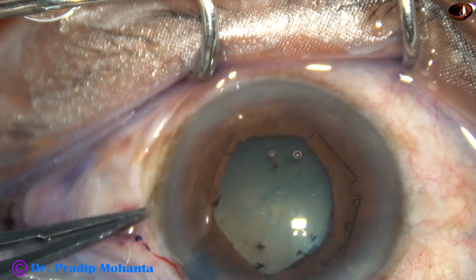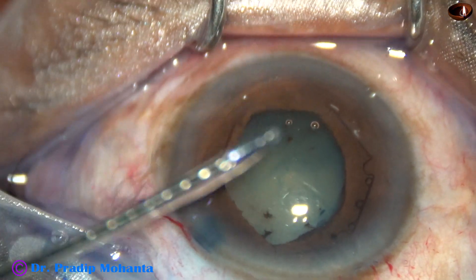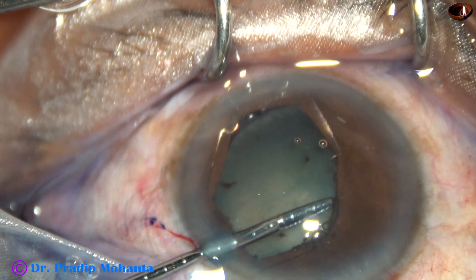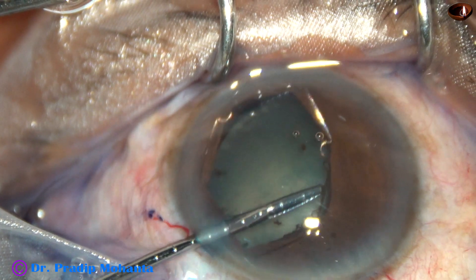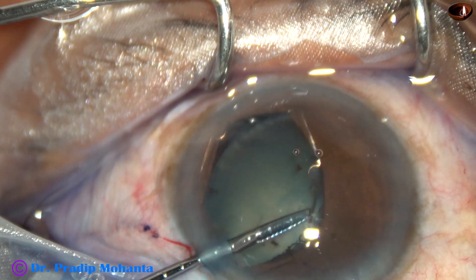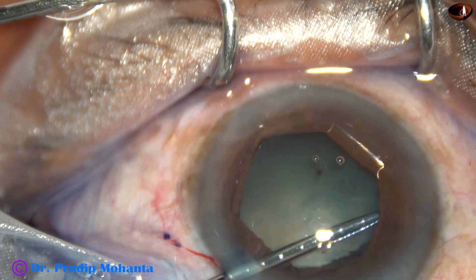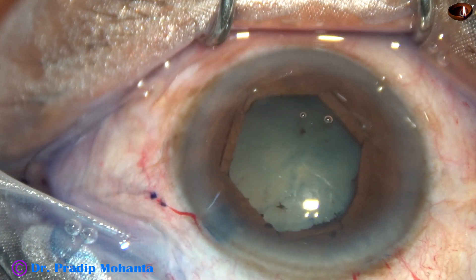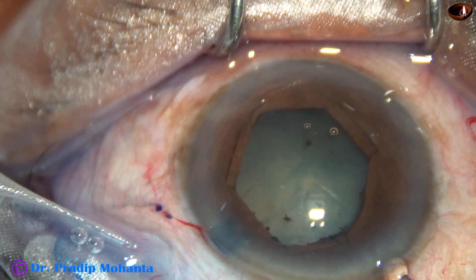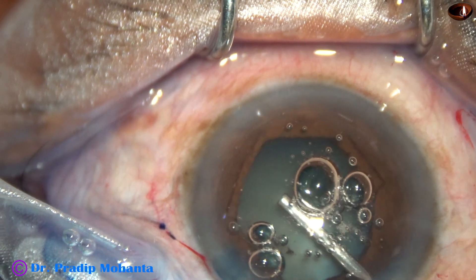If we use iris hooks, we tend to pull them too much and that causes damage to the sphincter pupil. So if you use iris hooks, don't pull the iris hooks to maximum — just pull it so that you can get a dilated pupil of about 5.5 or 6 mm, and you can do surgery through that opening. After placing the B-hex pupil expansion device, see the beautiful hexagonal shape of the pupil.